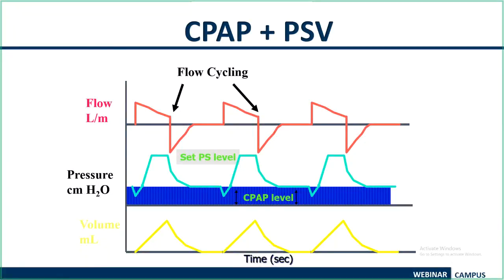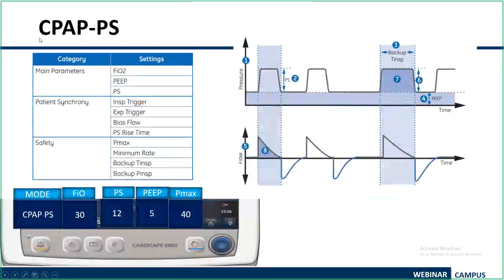Or in GE ventilators and others, we have something called a spontaneous breathing trial, or in some other ventilators you can have a mode called tube compensation, or ATC, etc. In tube compensation also, depending on the tube size, the patient weight, etc., the machine will calculate what support is required and the machine will decide on that. The same way when you put on spontaneous breathing trial, depending on these parameters, the machine will decide. Otherwise, in a simple way, you understand how to titrate the pressure support.